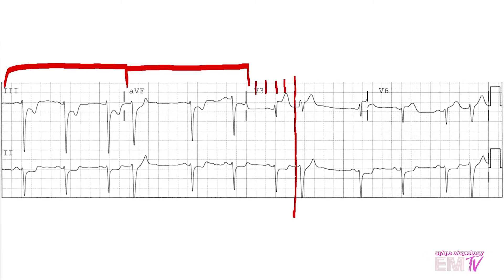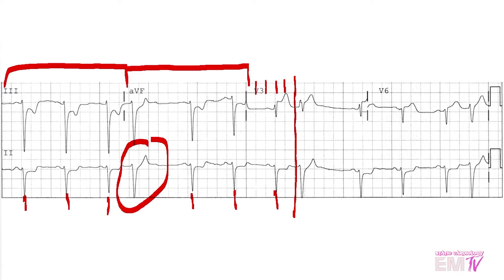Now that I have my 6-second strip, I'll count the R waves and get my rate. Now I left one of the R waves out because I believe that this is a PVC. It's a widened QRS, it tends to break up the R-to-R interval of the preceding normal R waves, and it doesn't have a P wave associated with it. Generally I don't count these toward rate because they tend to be non-perfusing, so I'll say that this rate is approximately 60.